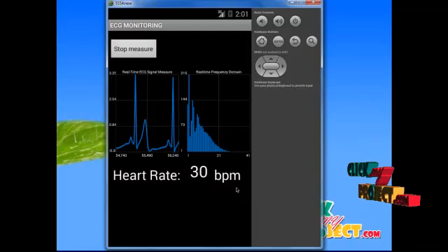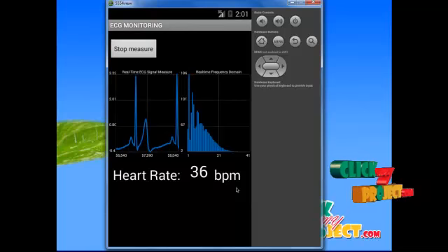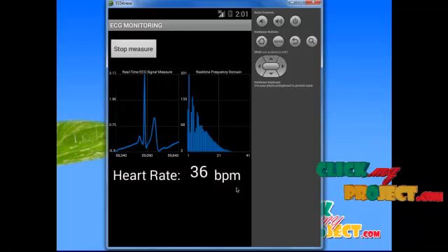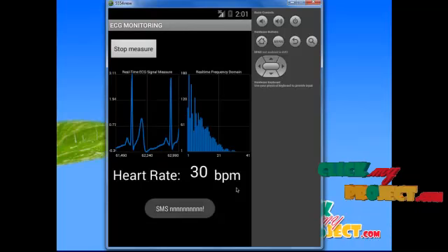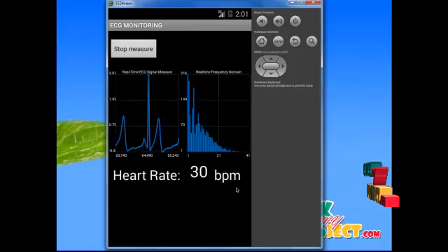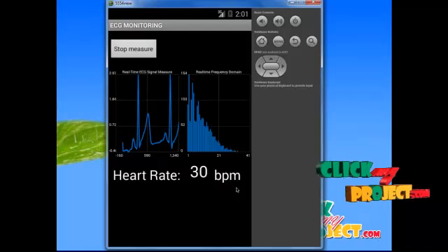We propose a system which will continuously monitor the ECG of the subject based on the Android OS platform. This system can monitor and diagnose the patient's heart condition in real time with an ECG sensor and generate an alert whenever a deviation is found. This system will analyze the ECG wave, generate the proper error message, and also send the ECG signals if necessary to the clinic or doctor's system.